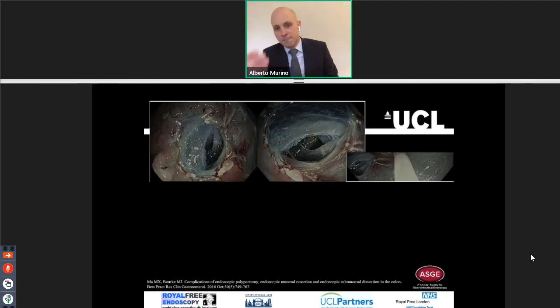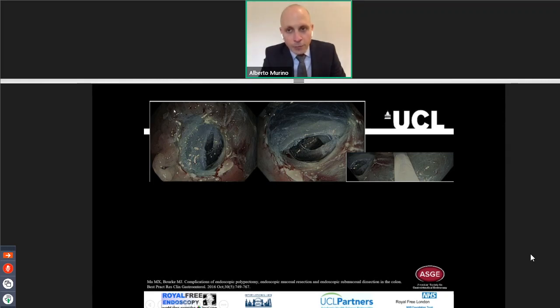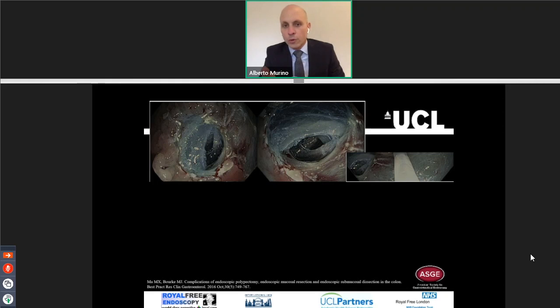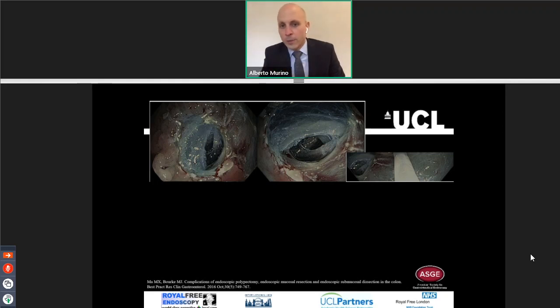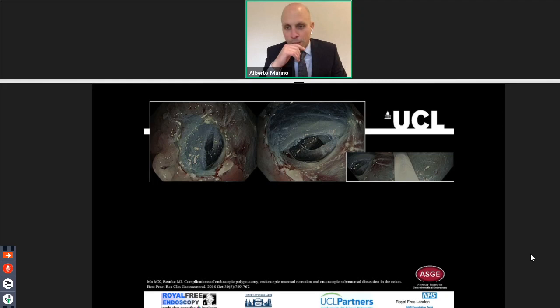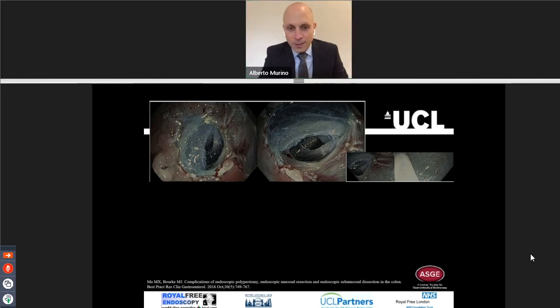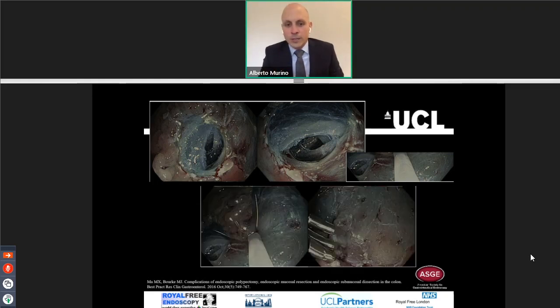This is actually a full thickness perforation. As you can see, around the perforation site there is still polyp left. The question is: would you carry on with the resection, or close the perforation and send the person for surgery? The answer that was correctly given: resect and then close. The rest of the polyp was completely resected and then fully closed. But it really depends on the patient's condition. If the patient is under GA or is fine with this perforation, then please carry on — finish removing the polyp and then close the defect, achieving both complete resection and perforation management.